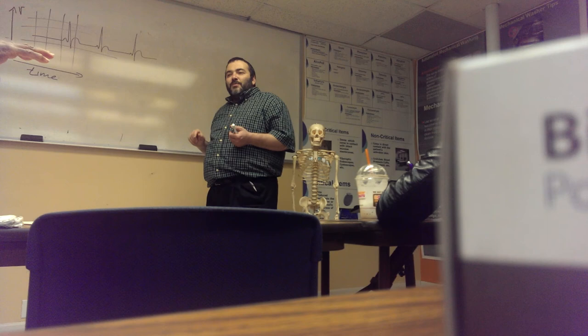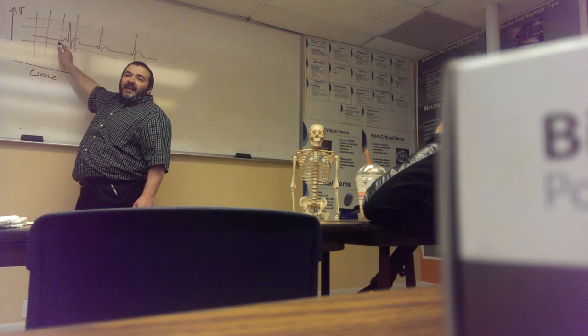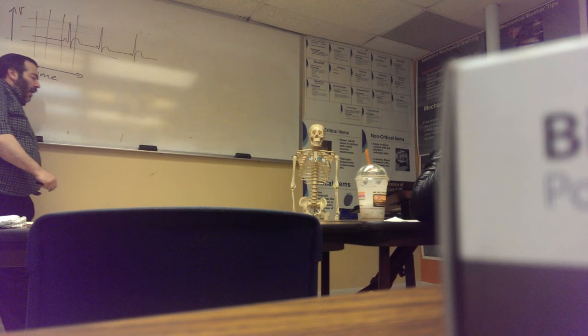Okay. Make sense so far? Yay, nay? Okay. Now, I want you to see that the EKG that I have here travels in a straight line along an imaginary baseline, right? So, in other words, I'm supposed to walk as if I'm an EKG going, watch this.